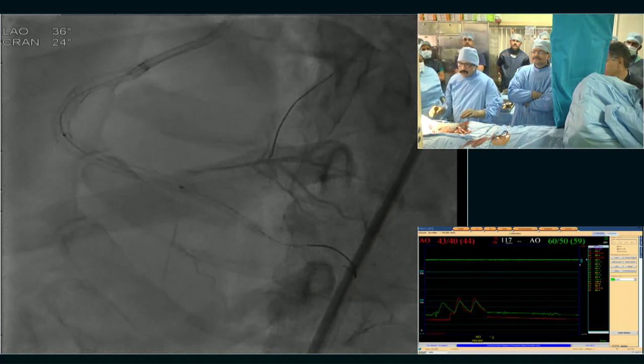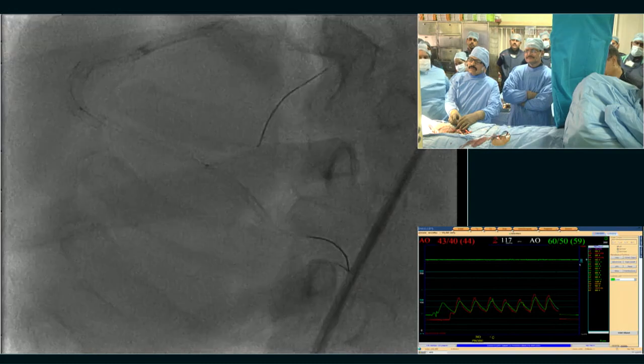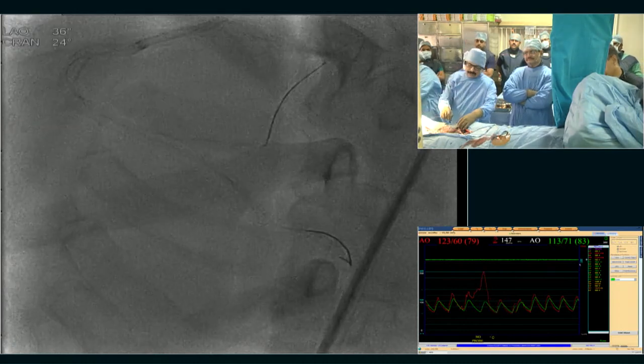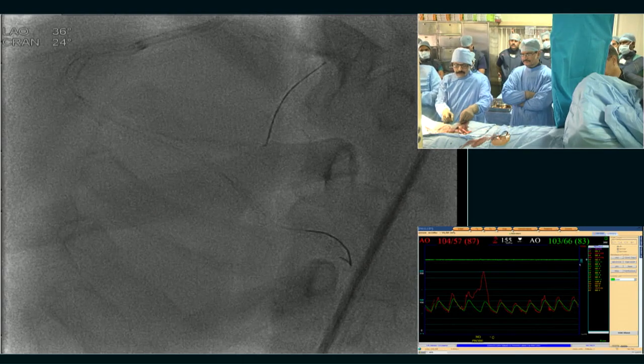We can open the PLV, not an issue with the stent. So now we are doing the 3.5 balloon for the proximal part of the stent, which is a 3.5 stent. So we are doing for the ISR a DCB of 3.5 into 40.